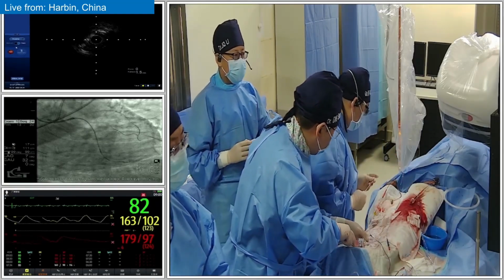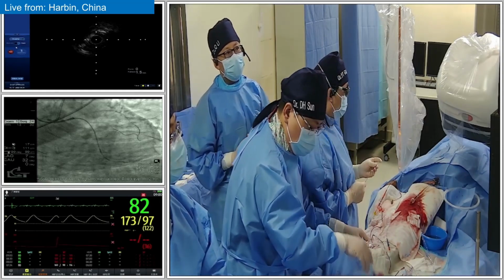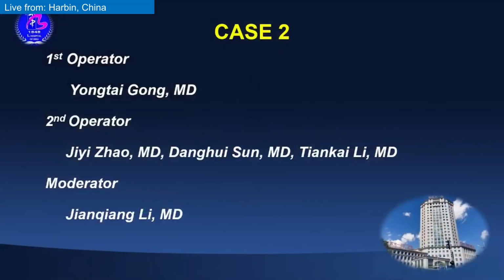Dr. Gong Yongtai is the first operator. Dr. Zhao Ji, Dr. Sun Danghui, Dr. Li Tiankai, Dr. Wang Dingyu are the rest of the operators. My name is Li Jianqiang. I'm the moderator. So Dr. Zhao will introduce the case first. Dr. Zhao, please.